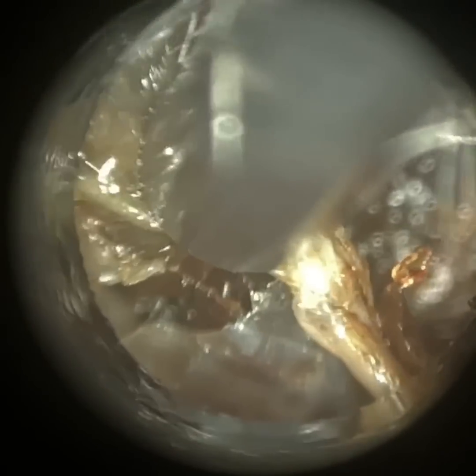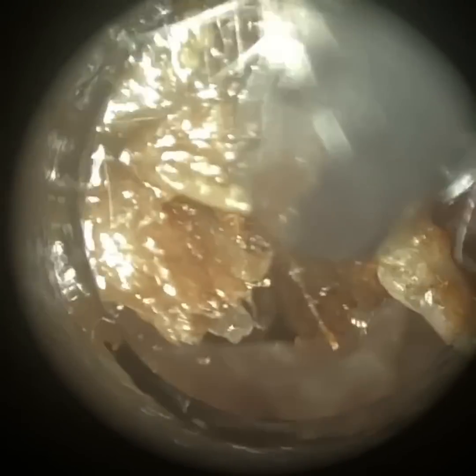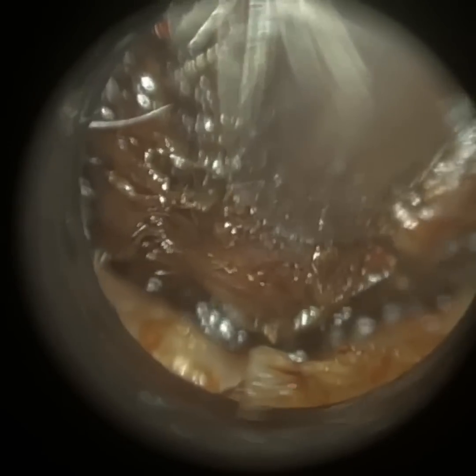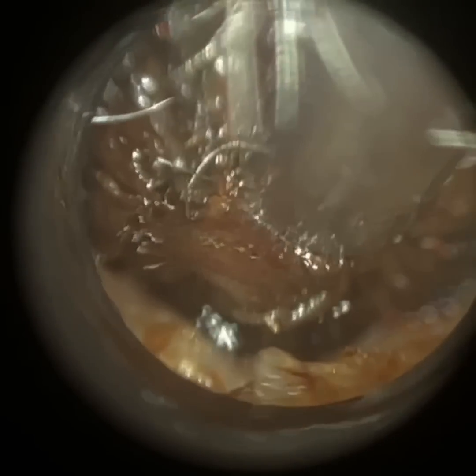Now, I don't generally perform many typical duties that audiologists normally would, because I don't prescribe hearing aids anymore. I'm solely more or less focused now on earwax removal and all my training and development of new devices and equipment. But I invited her in any case so she can observe me performing earwax removal, and it was really great to spend the morning with her today.